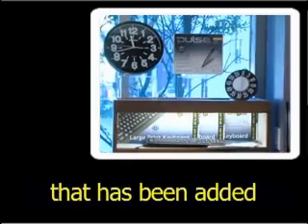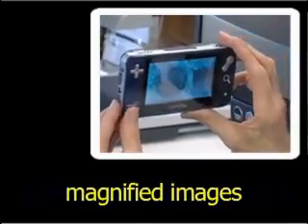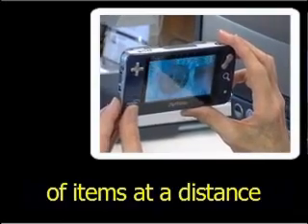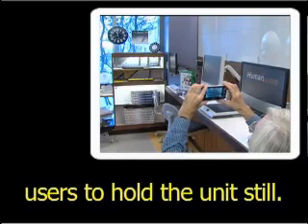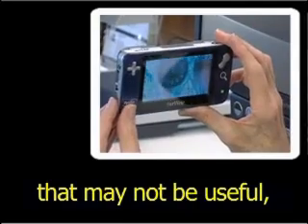One additional feature that has been added to some models is distance viewing. When viewing highly magnified images of items at a distance, it can be difficult for some users to hold the unit still. This can result in a shaky image that may not be useful.